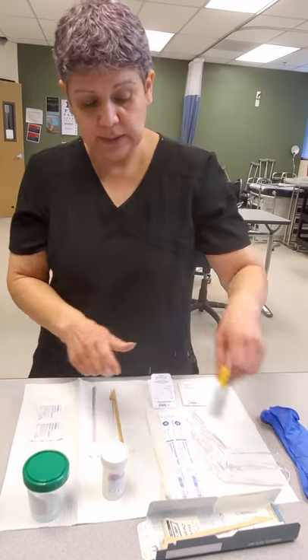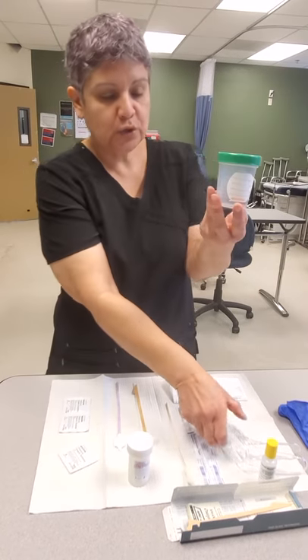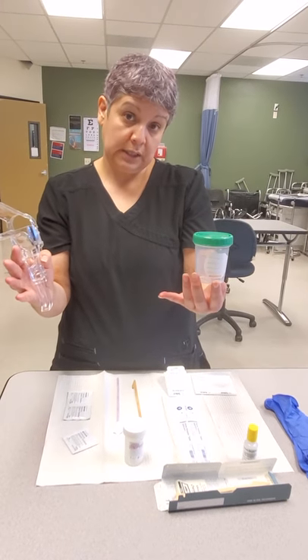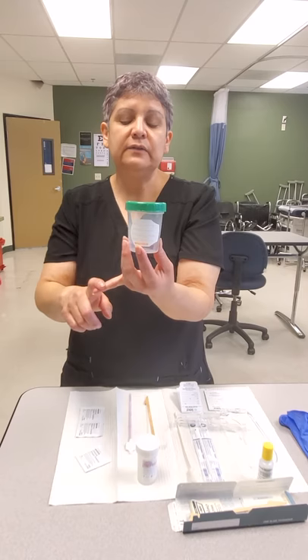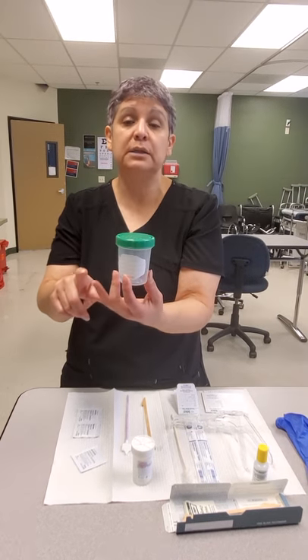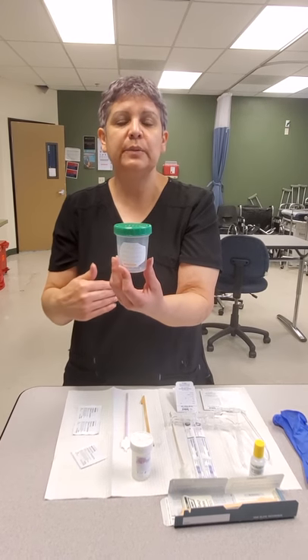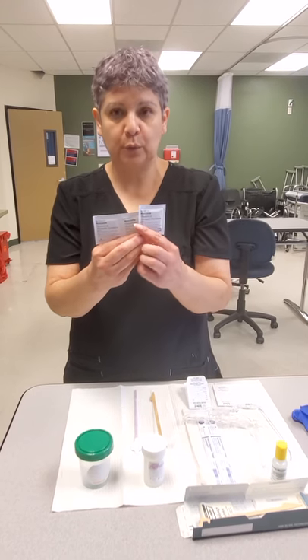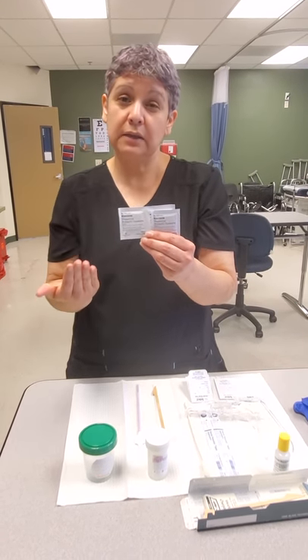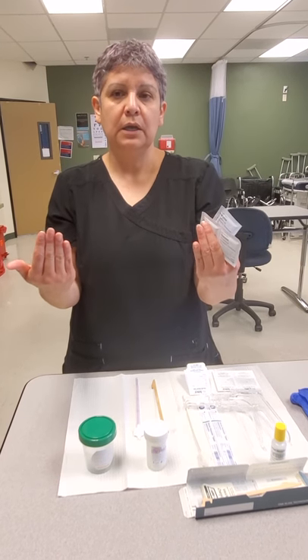One thing I forgot to mention: we need to make sure patients relieve their bladder before the exam. We do not want to use the vaginal speculum to open the vagina and push on the bladder if they have not done so. Get a urinalysis sample — it relieves the bladder, and we will also be doing a urinalysis and possibly a urine pregnancy test or urine culture. Before patients get undressed, get that urine sample. Also provide three obstetrical wipes. They must clean one side of the labia majora, the other side, and one right down the center of the vagina to remove as much bacteria as possible for accurate testing.